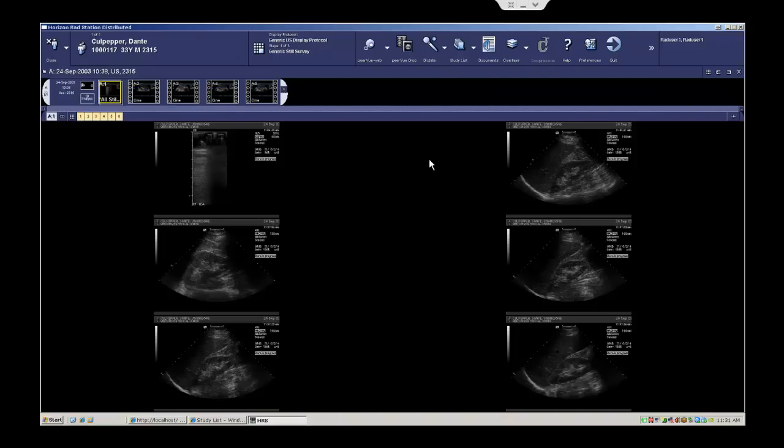This is designed because clinicians spend a lot of time during the day looking at prior or comparative studies, and in a sense they're passing judgment on the prior diagnosis by the original reading radiologist. PeerView provides a quick, integrated way for them to submit feedback on that radiologist's performance and diagnosis directly from the PACS desktop.